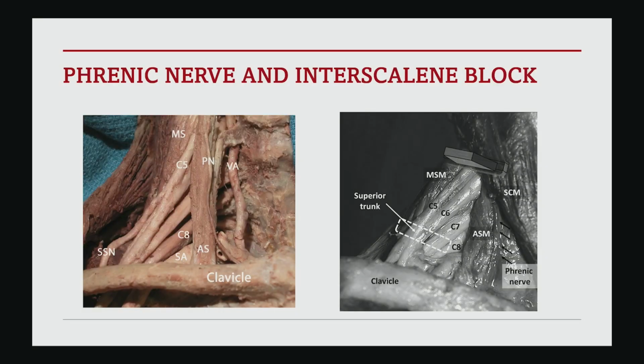This we have discussed before. With superior trunk block, the probe moves down, the distance between the brachial plexus and the phrenic nerve increases, so that there is decreased chance of involvement of the phrenic nerve. There are other diaphragm sparing nerve blocks as well. We have a selective suprascapular and selective axillary nerve block. We can combine an infraclavicular block with a selective suprascapular nerve block.